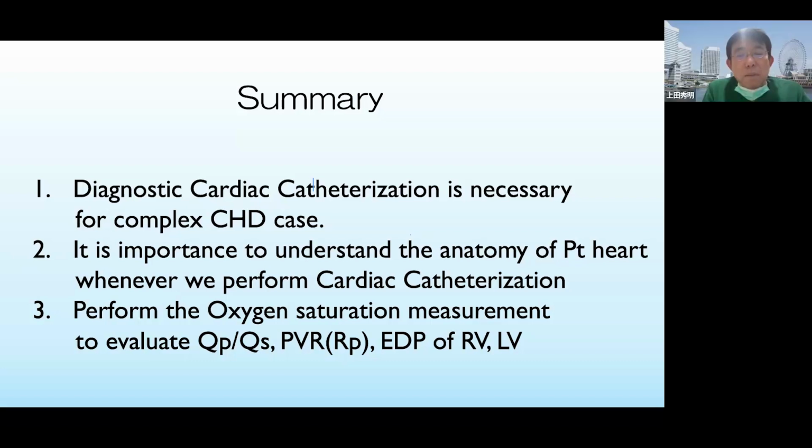If we have a PFO, we can enter the catheter inside the pulmonary vein and measure the pulmonary vein wedge pressure to estimate the pressure of the pulmonary arteries.